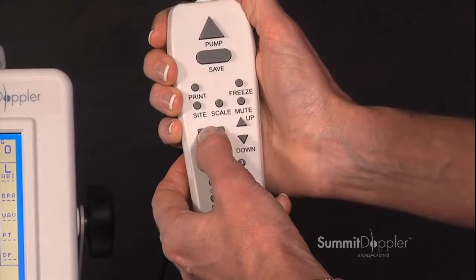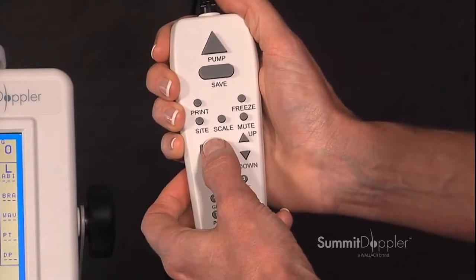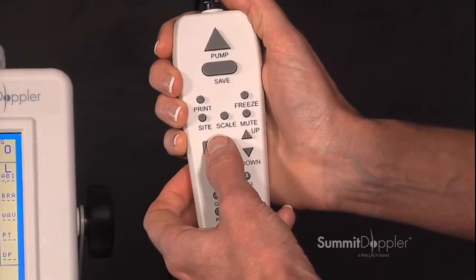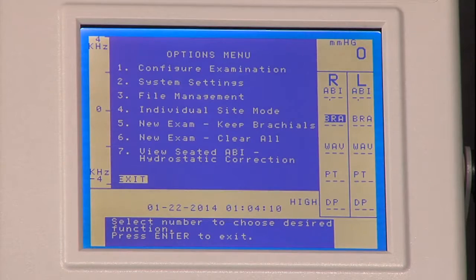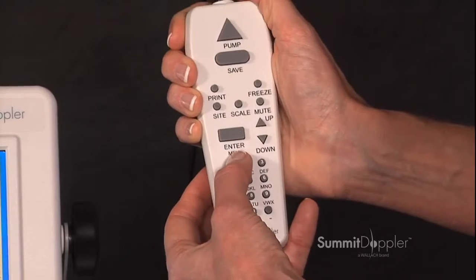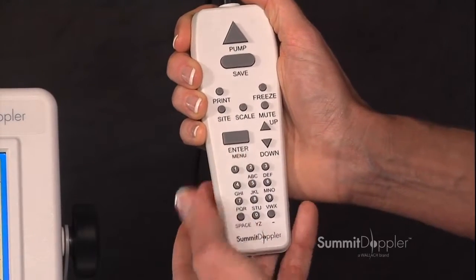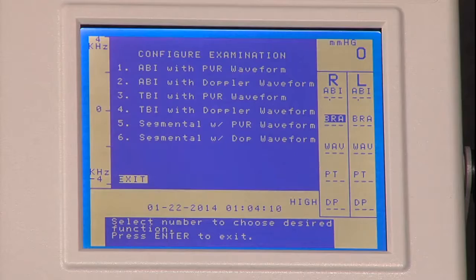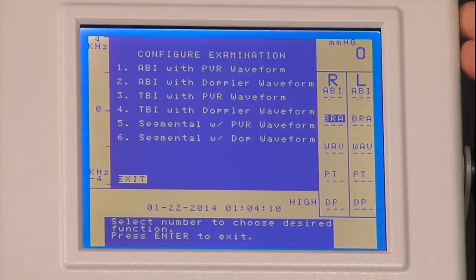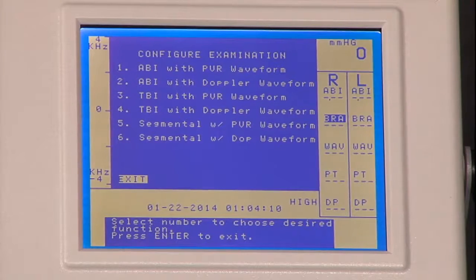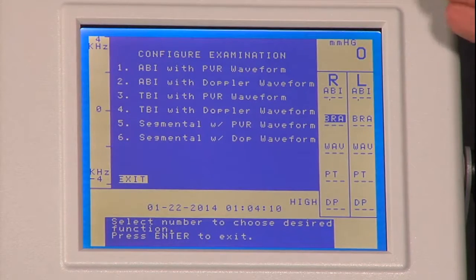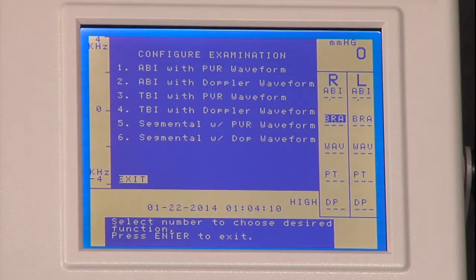Pressing the enter menu key will open your options menu. Pressing the number one button on the hand control will open your configure examination, which lists the different exams that you can choose to perform.